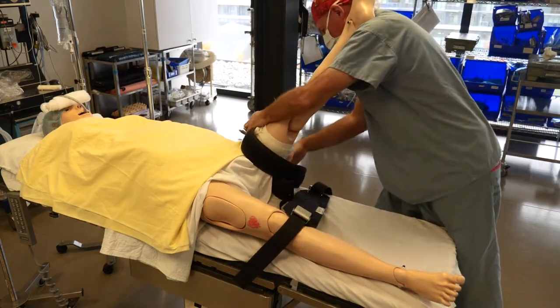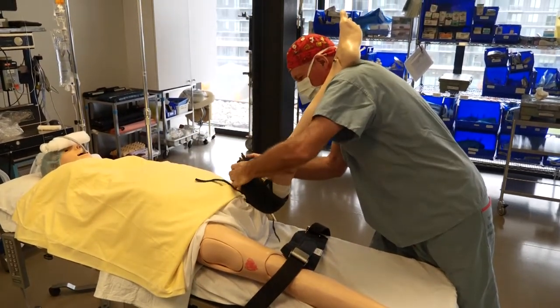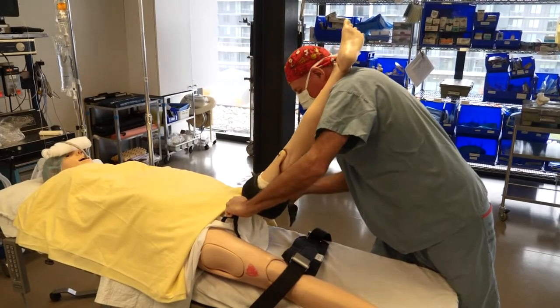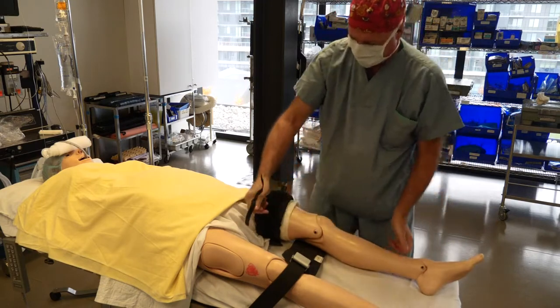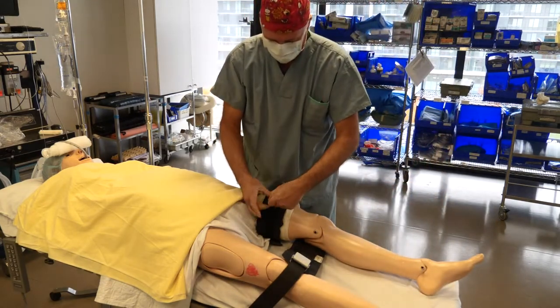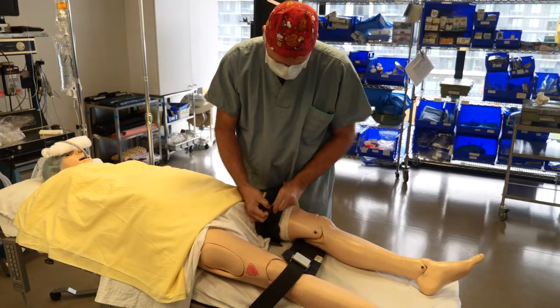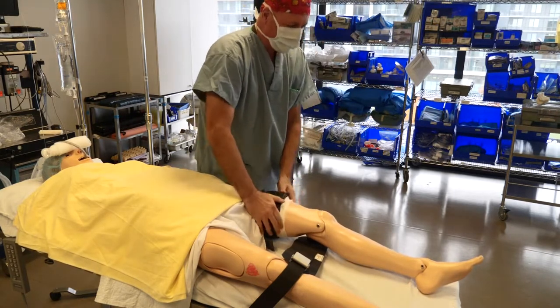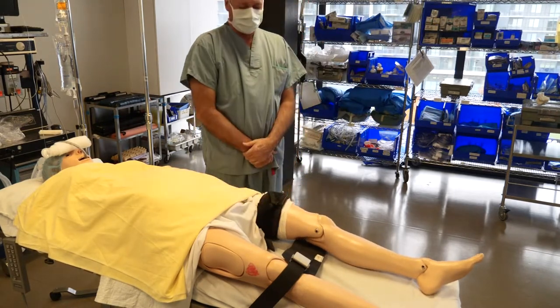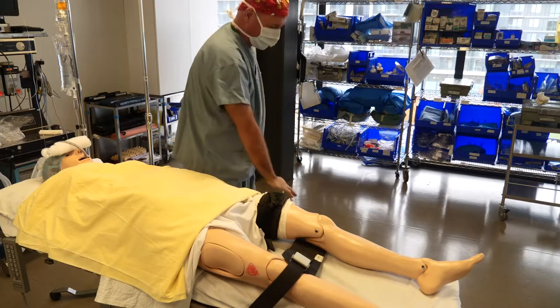He then applies a tourniquet around that soft material. The tourniquet type and style will be determined by the patient's leg size and also by the surgeon's preference. He ties the tourniquet ensuring that it's taut but not too tight, and he will then attach the tubing onto the tourniquet machine.